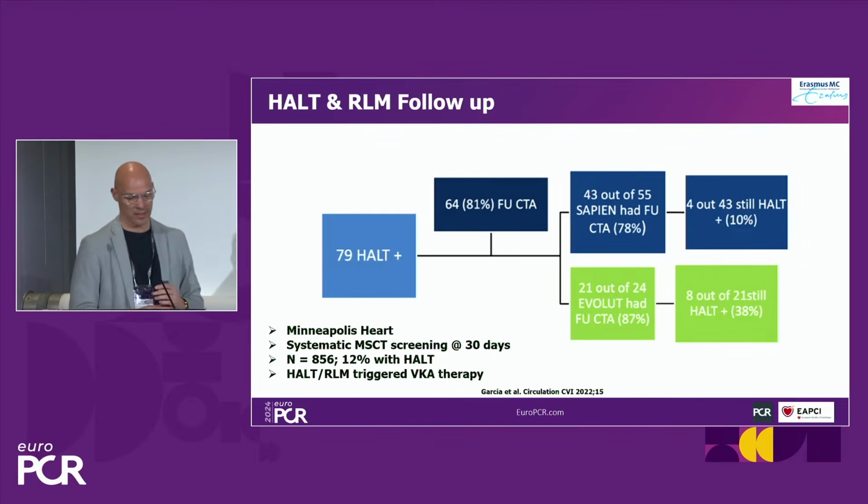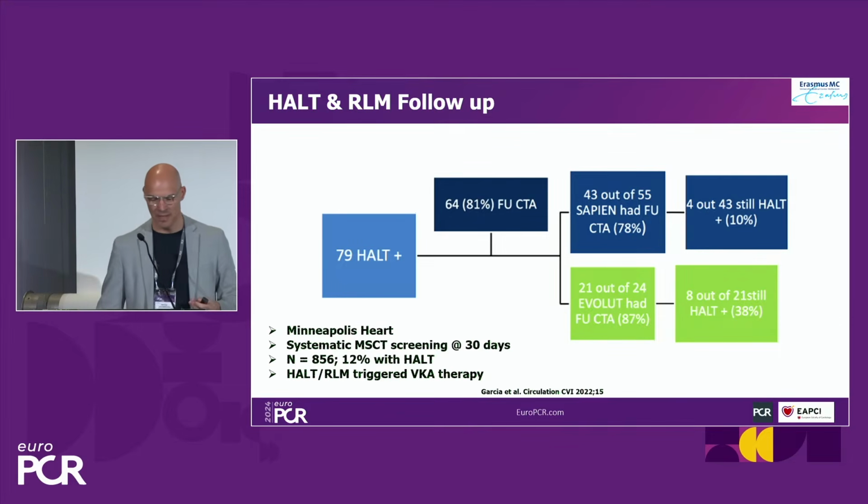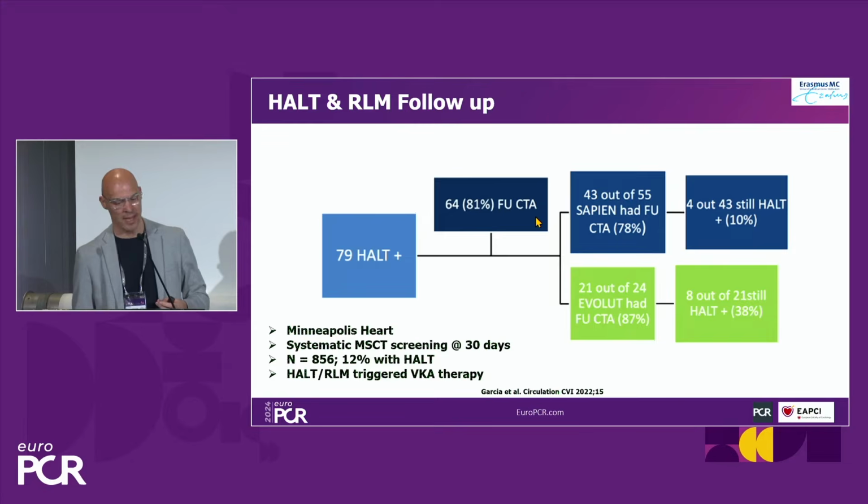This is the last slide that I wanted to show for this talk. This is study data from Minneapolis. They had 79 patients who had HALT by CT scanning. They did follow-up CTs in 81% of these patients. And then again, it's interesting to see what's happening when you do change your antithrombotic therapy.